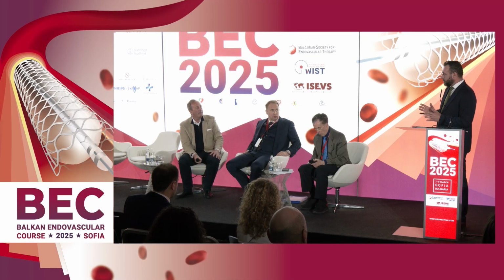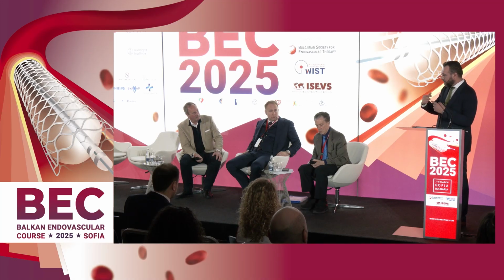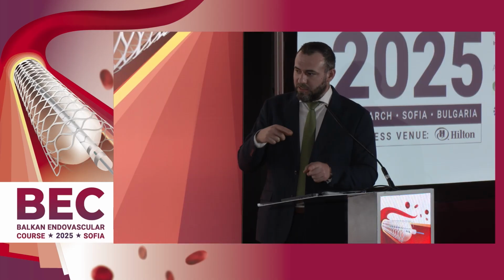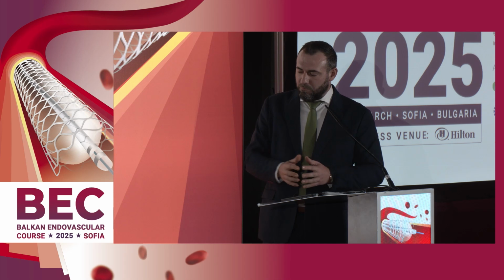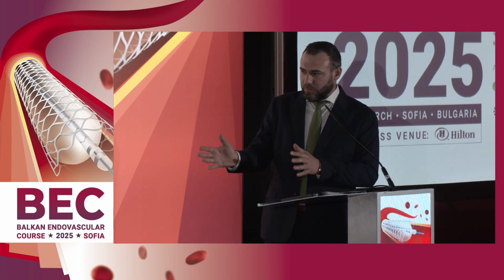For triple fenestrations, our routine in Military Medical Academy is, when we have the CT, I'm doing the sizing. I have colleagues who are caring about the patient. They are placing a left axillary access and putting the compliant balloon in the descending aorta, and are collaborating with anesthesiologists.